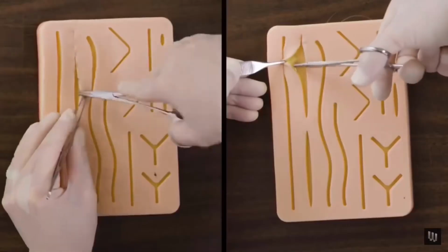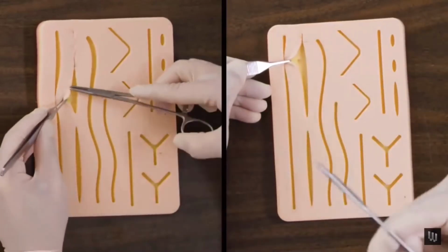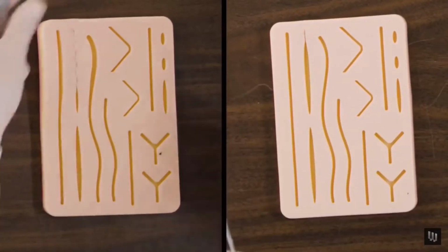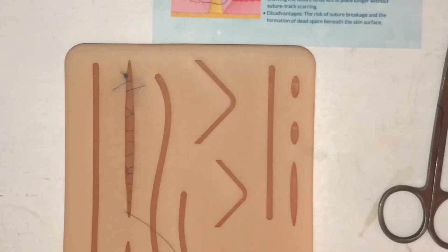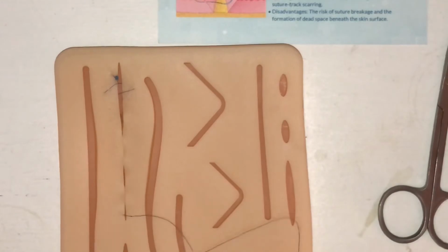Even if they don't look perfect, these tend to heal up okay, but you can make this look like nothing ever happened. Which is not what's happening to your patient. Oh well, they're going to have a nice memento of their time with us. All right, so let's assume that the rest of this is going to go flawlessly. I clearly didn't pull hard enough because it's not going to close at all. Boom, magical. Now I've got to figure out how to close.